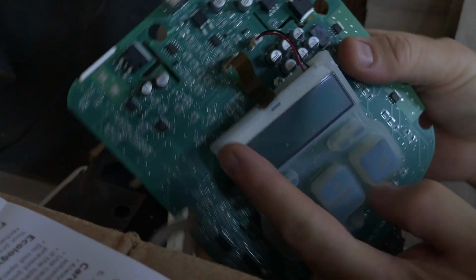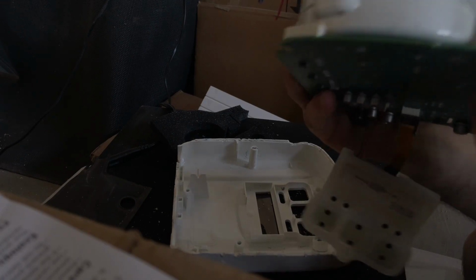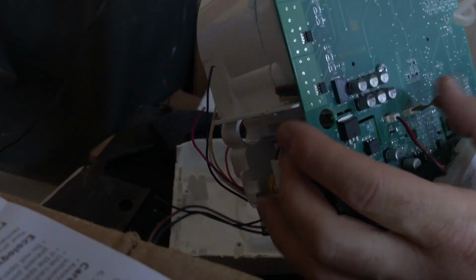Okay. So there's our display. Nothing magical about this. Our board. Maybe we can find a date code on here. Now, how is this held on here? There's some tubing, which I believe is a humidity sensor or something, because this is going down to the board over here to some kind of component. It's not connected to the water reservoir. I think this is a humidity sensor, and this was just checking the humidity. There's power. We should be able to take the board off here. There's some more screws. There's another one there. Okay, here we go.